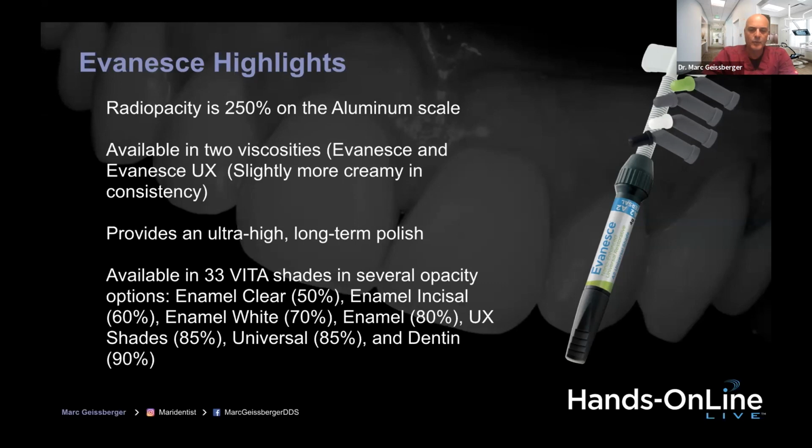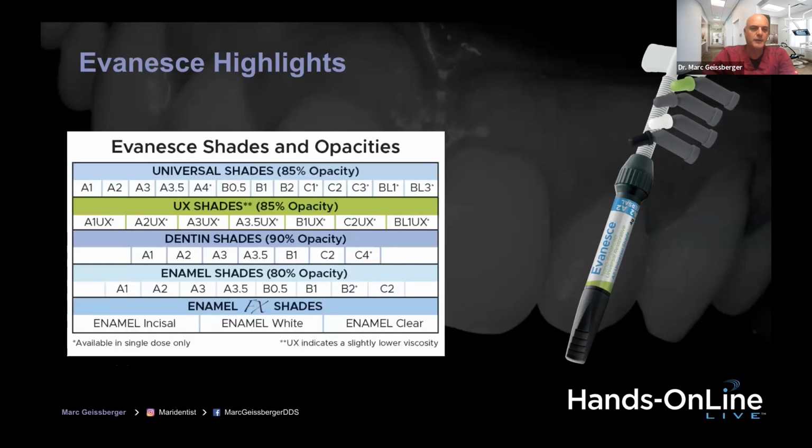This composite works beautifully, especially for class 2s. Lots of shades available. In fact, in my office, we don't stack every one of these shades because that would be overwhelming. I have a select few shades in the enamel and dentin shades that I use very routinely.